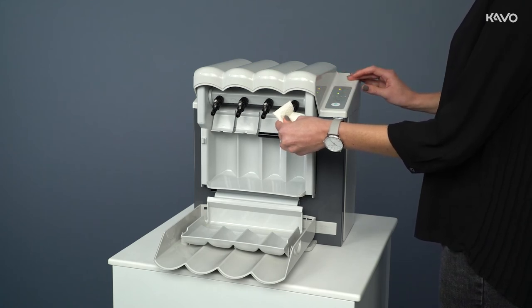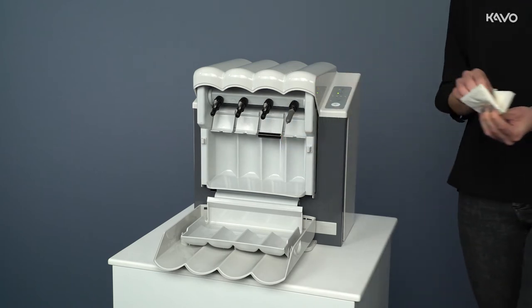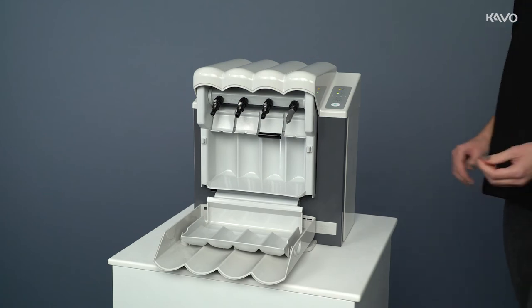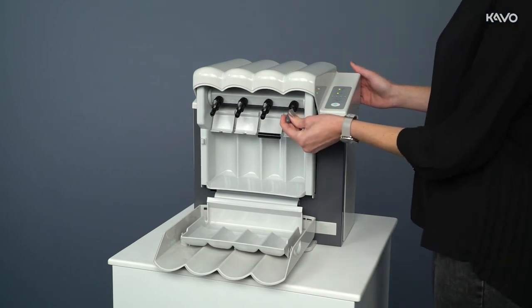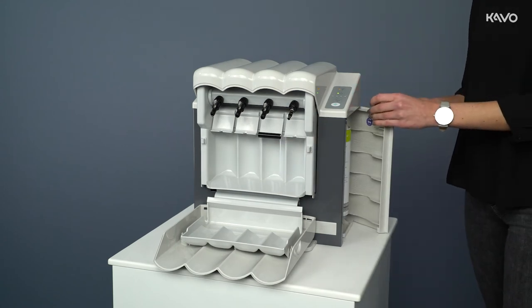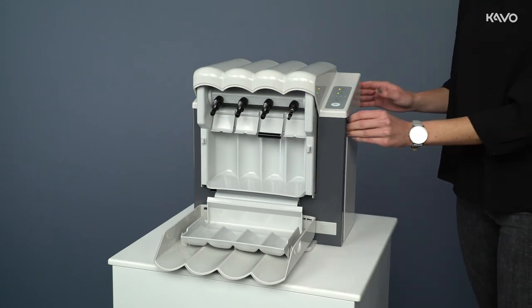Kavo QuattroCare Plus not only optimizes the speed and efficiency of cleaning and oiling your handpieces, it will also benefit your practice economically. The QuattroCare Plus maintenance system means that manually oiling handpieces one at a time is no longer necessary, saving you time and money. The QuattroCare Plus recognizes how many handpieces are inserted for oiling and will only oil those present, without wasting any of the QuattroCare Plus spray.